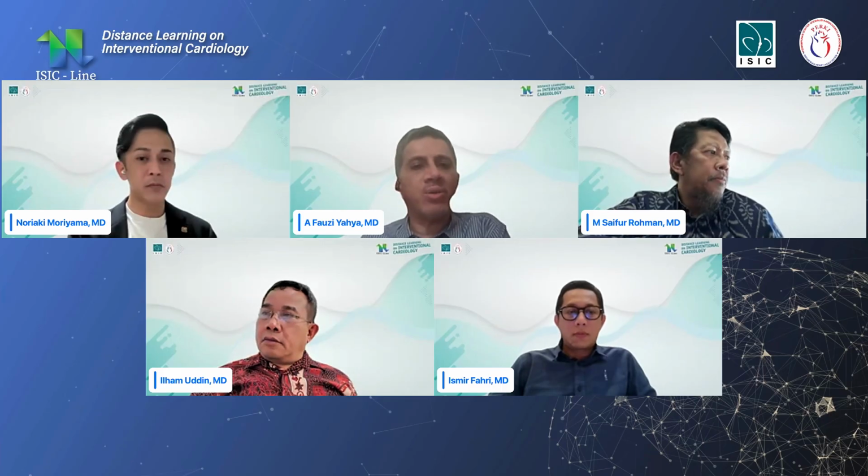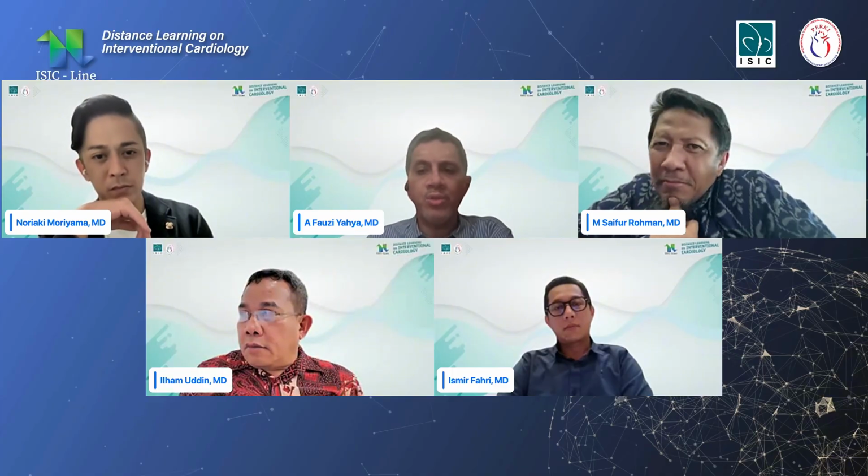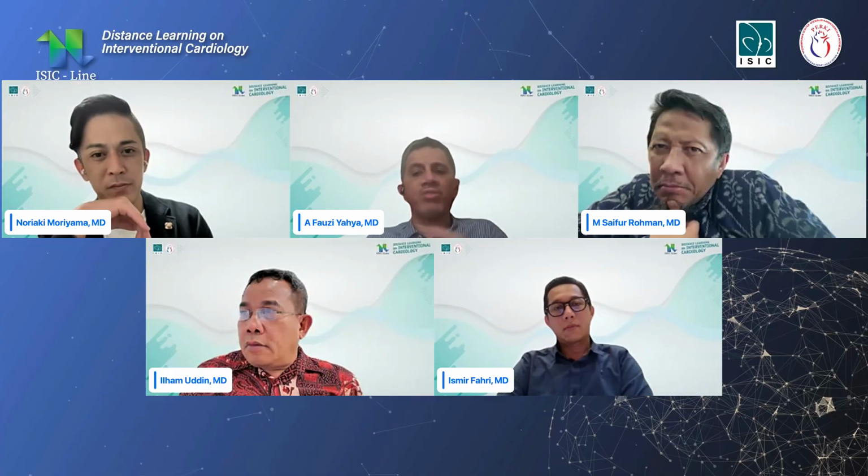Okay, and then the brief response. Looking at the angio that you showed us in the case, we don't see any calcified lesion, as Dr. Bambang mentioned in the text. But the OCT showed a non-eruptive calcium nodule. Do you think that a CT scan beforehand may help to define the landing zone if OCT is not available?